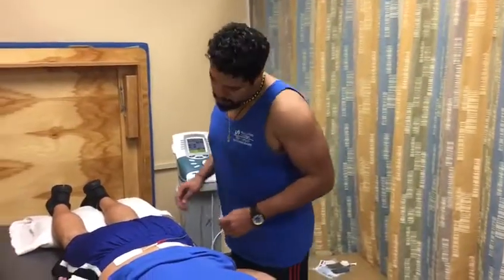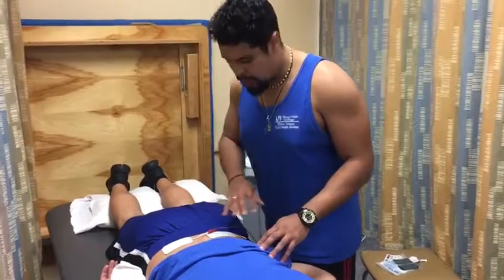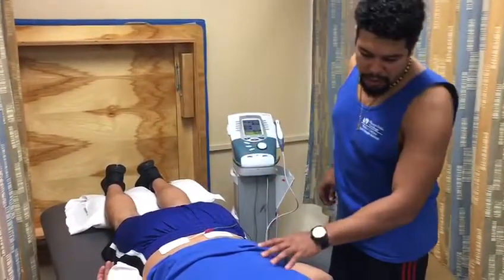5 minutes later, all right, Daniel, how do you feel? Any pain? Okay, make sure that the skin is nice and intact. No redness. Perfect. I'll be back in 10 minutes.